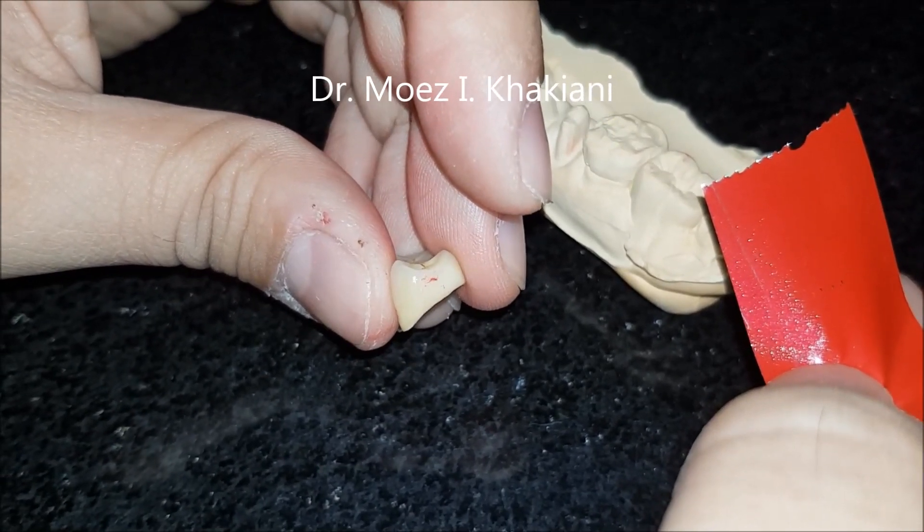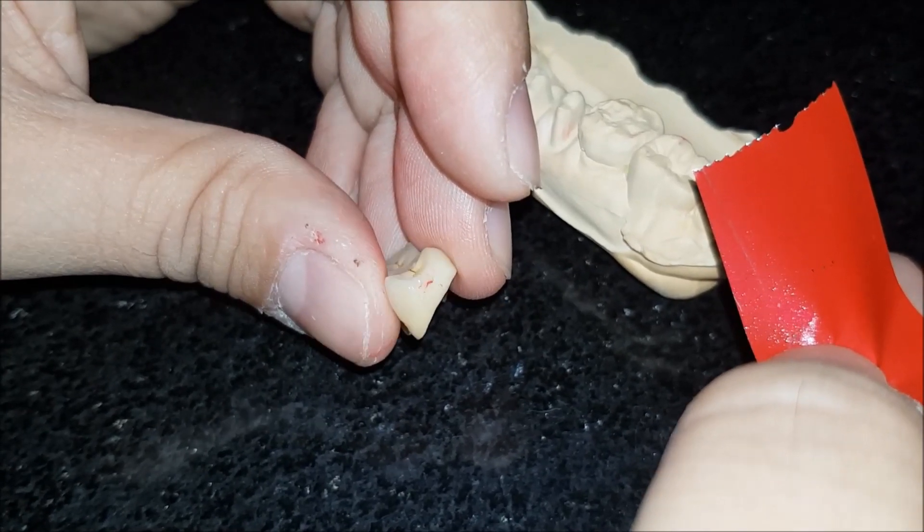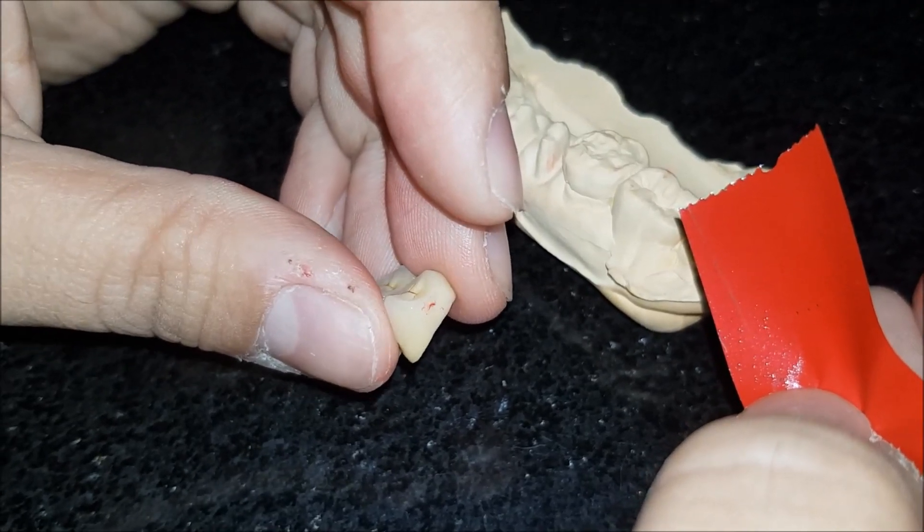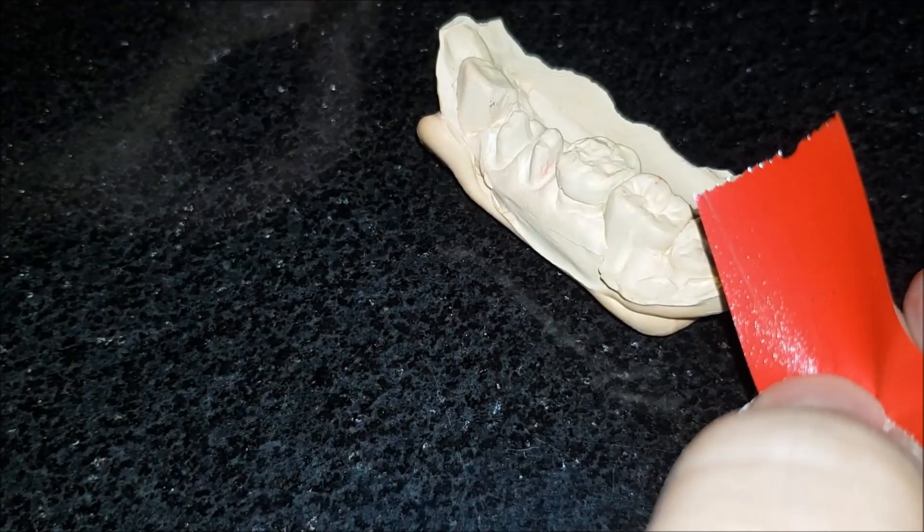Now imagine if I had a tight contact and I wanted to know where the contact is tight and what surface needs to be worked on. I will most definitely look at doing this with the 12 micron film.